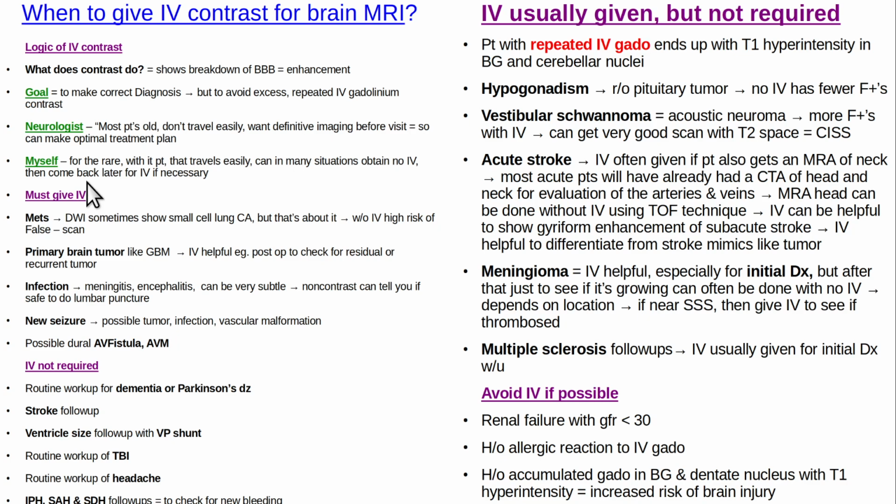Usually the university magnets are better shielded in the big hospitals, some type of big hospital. I'm not that big a fan of these outpatient MRI centers where you have open magnets because usually the pictures are not as good. So it depends what you're trying to image, but in general, if you're going to have to get an MRI, you want to get a good MRI. All right, but that's a whole other issue, talking about quality control with regard to the type of magnet.